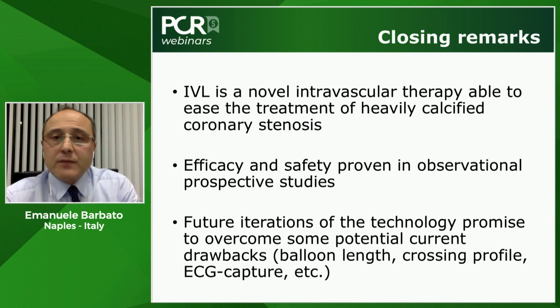We just learned from Michael that future iterations of the technology promise to overcome some potential current drawbacks. We heard of a longer balloon coming up, perhaps with a better crossing profile, with the possibility to also deliver more pulses per treatment. That is also a feature that is most likely going to improve. And perhaps we are going to hear more about this ECG capture and a way to overcome it.